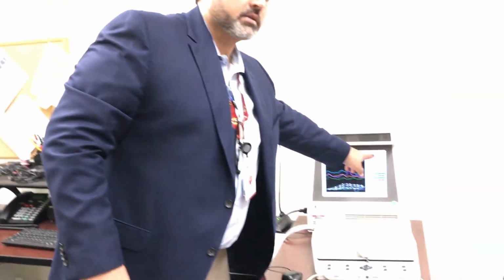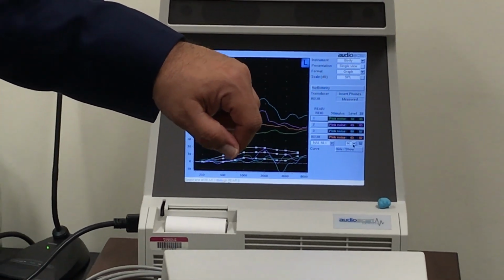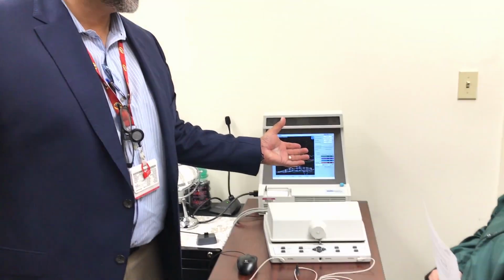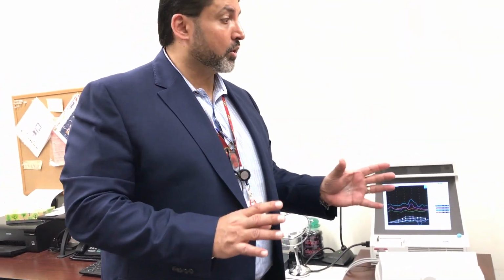And use pink noise. Use pink noise, because if you use a pure tone, what happens? Standing waves. Okay? So that's it. That's what that first piece is. It shouldn't take you more than, if I had to guess, 20 minutes to do that. And I'm being liberal here.